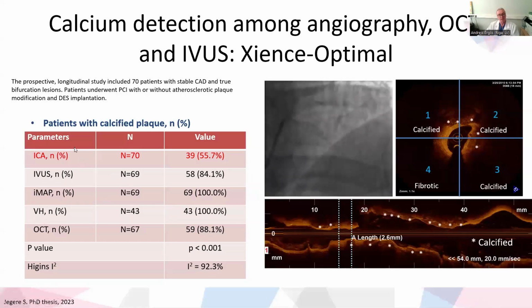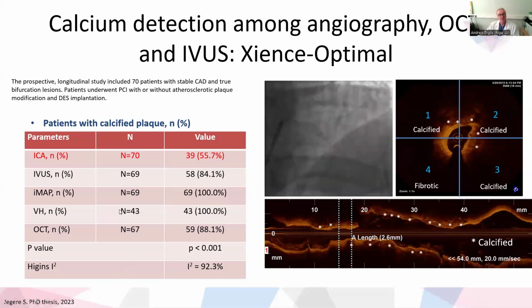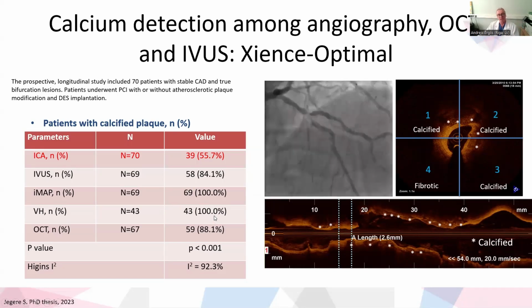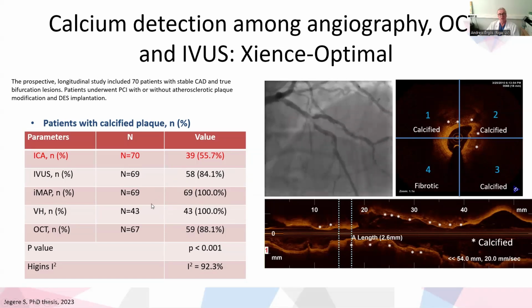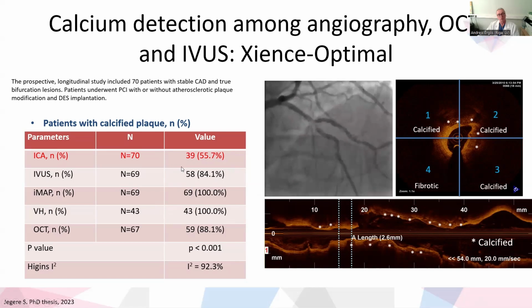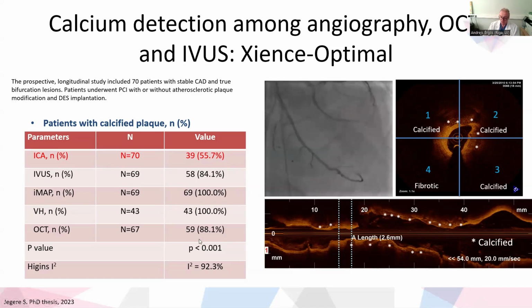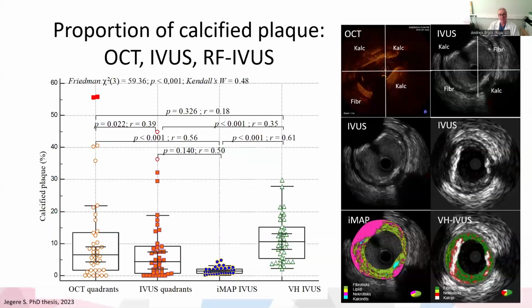And for example, if you look again, it is done by Professor Riga in this PhD thesis, and it is very interesting to see which is the more sensitive or specific method to use. But I'd say that all those methods which we used inside, instead of intracoronary angio, show us much better what the environment inside is and what we treat. And it's not always calcium. We can also look at soft plaques and others.